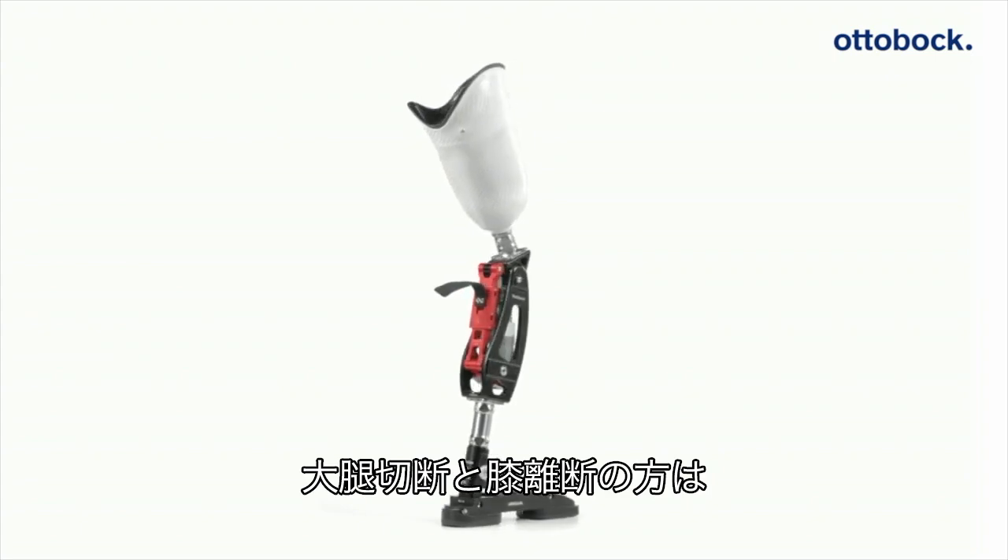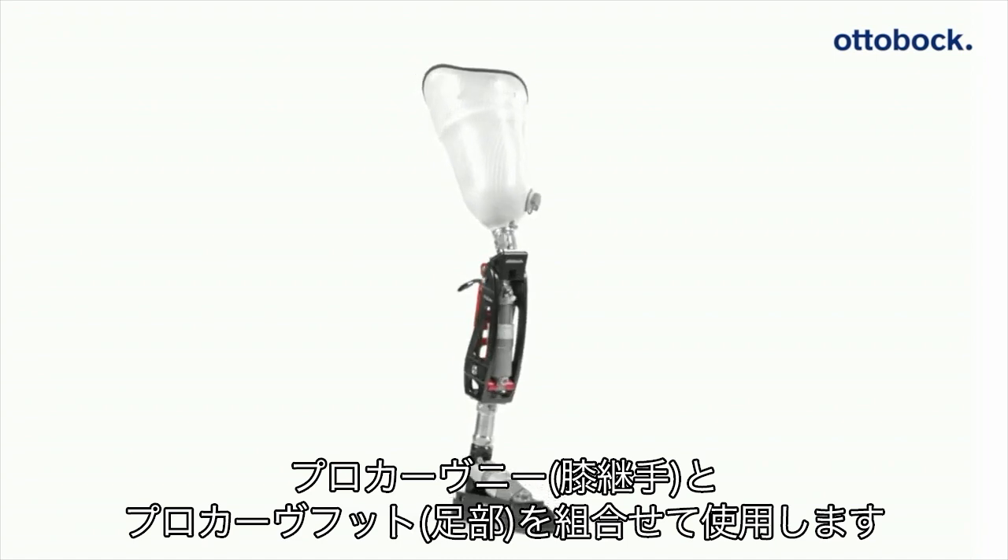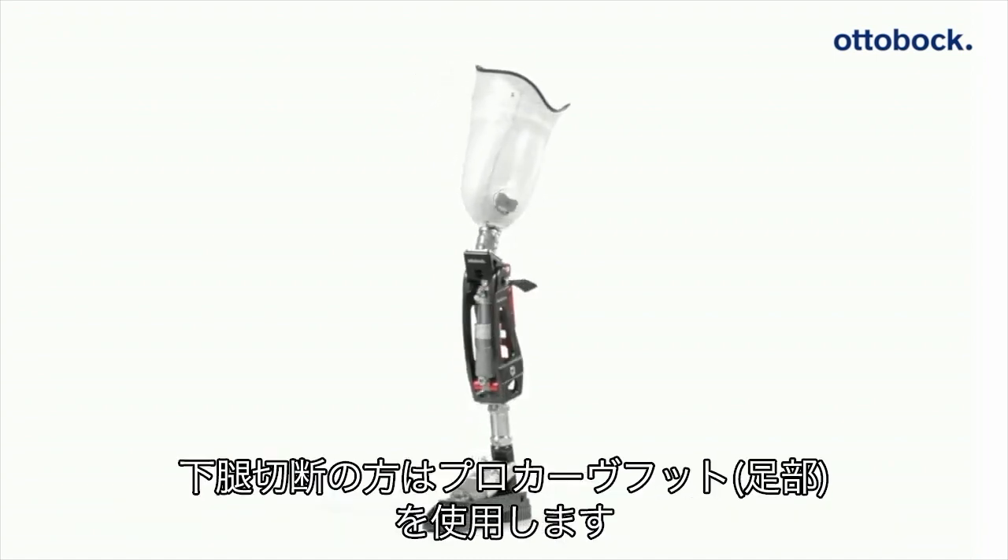The foot and knee combination is suitable for knee disarticulation and above knee amputees, while below knee amputees can take advantage of the ProCarve foot component.